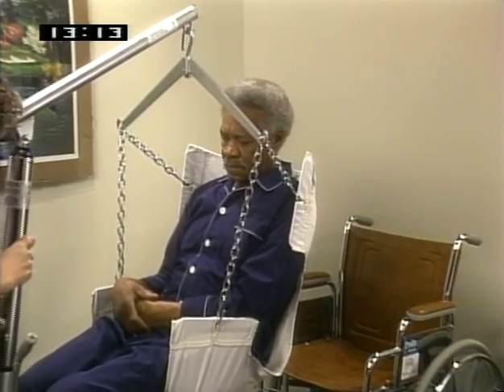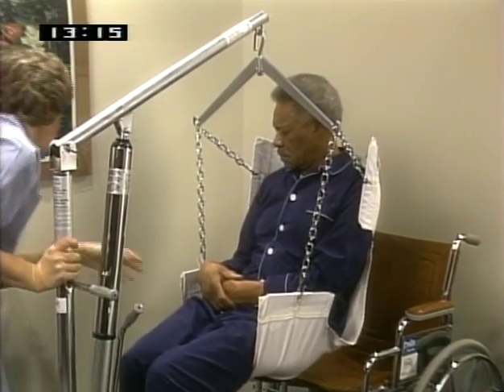Let's stop for just a moment to reiterate some points about good body mechanics. As you work with the Hoyer lifter, maintain a wide base of support with your knees flexible. Keep your body positioned close to the lift. Shift your body weight for leverage to help move the lift. Watch Judy follow these principles as she moves Tom into the chair. Position the lift over the wheelchair, rolling the legs around the wheelchair.